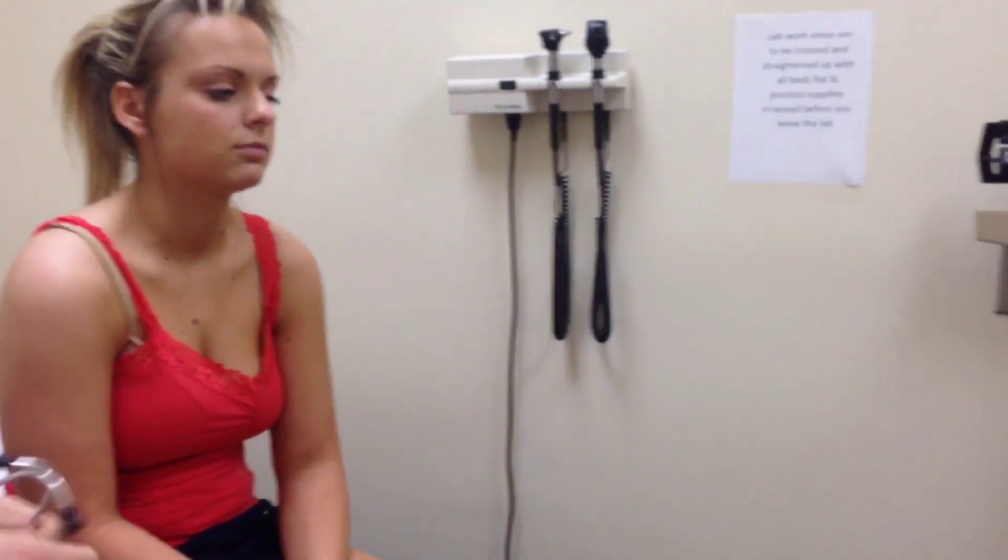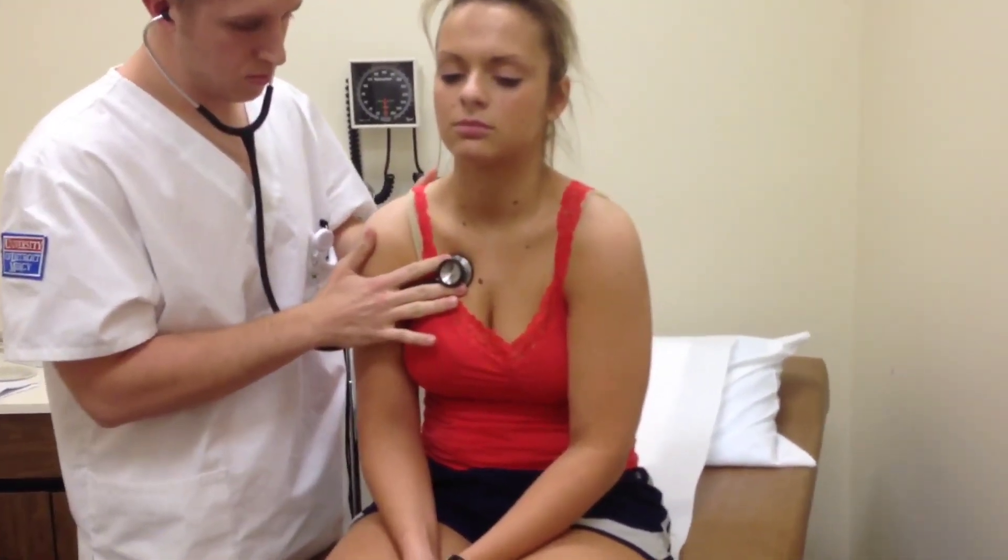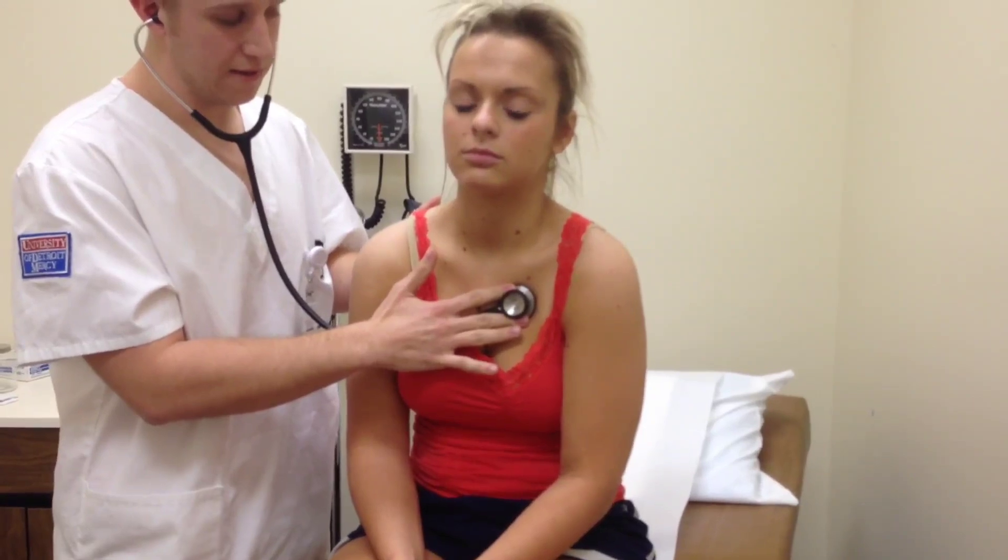Your heart sounds are all right. Let's start in the right second intercostal space, which is the aortic area. I'm going to move over to the pulmonic, which is the second intercostal space on the left side.